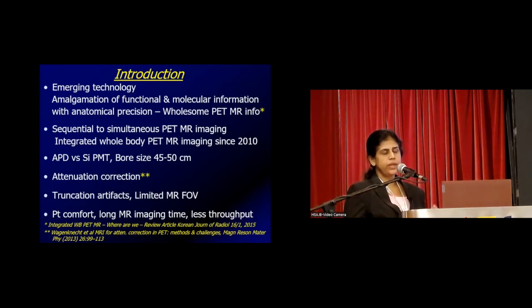Next, when the PET insert had to be kept inside the MR gantry, the bore size had to be reduced. And they also had to improve on the PMTs. So the SiPMTs have been found to be the ideal electronic gadgets these days in the simultaneous PET-MR system.